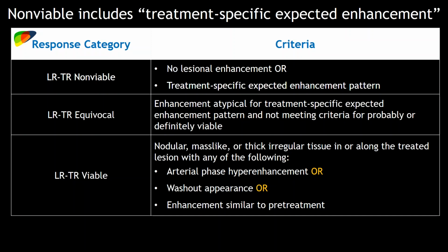Sometimes it even gets difficult to qualify it correctly as just a bland thrombus because it's sitting right next to the tumor. I know there is no arterial enhancement and the vein is not expanded, but in a scenario like liver transplant, you really get biased, you really get pressured about whether it is really tumor or not. So yes, I've seen this especially after SBRTs.